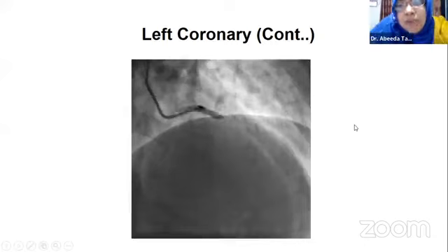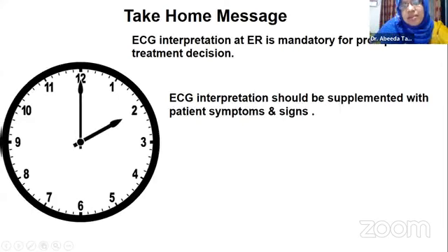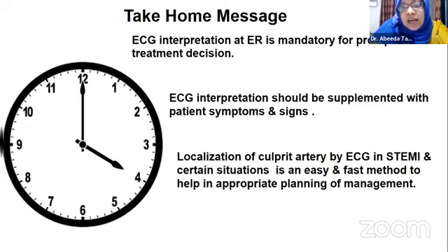So this is my last case. I'd like to say that my take-home message from today's presentation is that ECG interpretation in the ER is mandatory for prompt treatment decisions, and it should always be supplemented with symptoms and signs. Localization is not very difficult, so it is easy. And while we are preparing the patient, we can at least try to pinpoint the location.